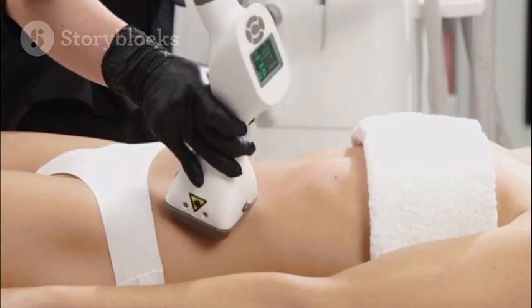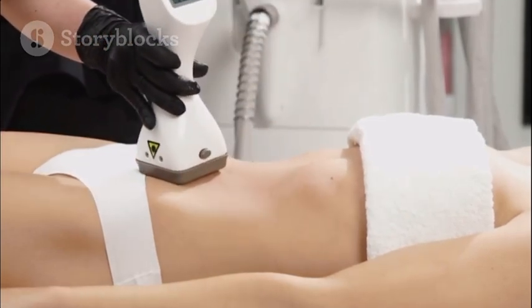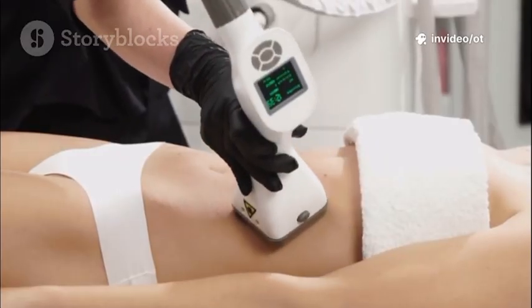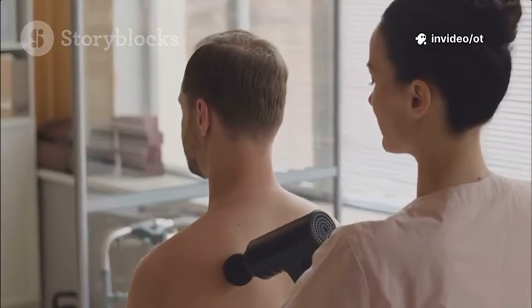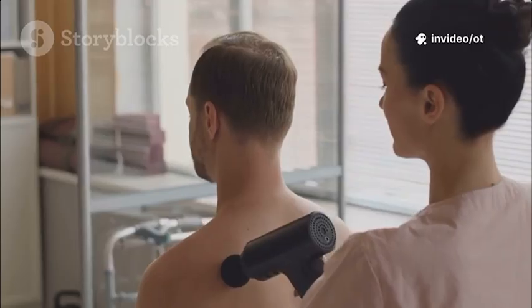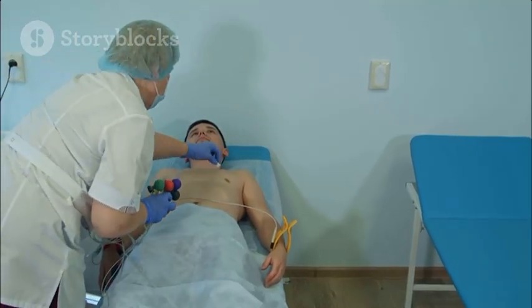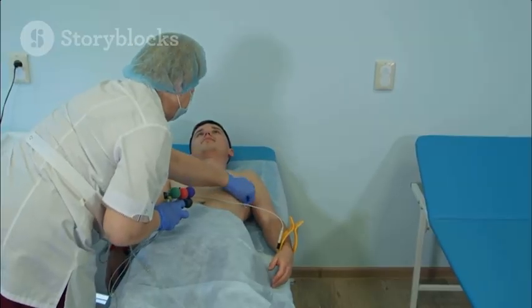Intensity is typically 0.5–1.5 W/cm² for thermal treatments. Tailor with patient feedback. Treat for 5 to 10 minutes depending on area and energy needed. Keep the transducer moving continuously at about 4 centimeters per second with adequate gel to avoid hotspots.